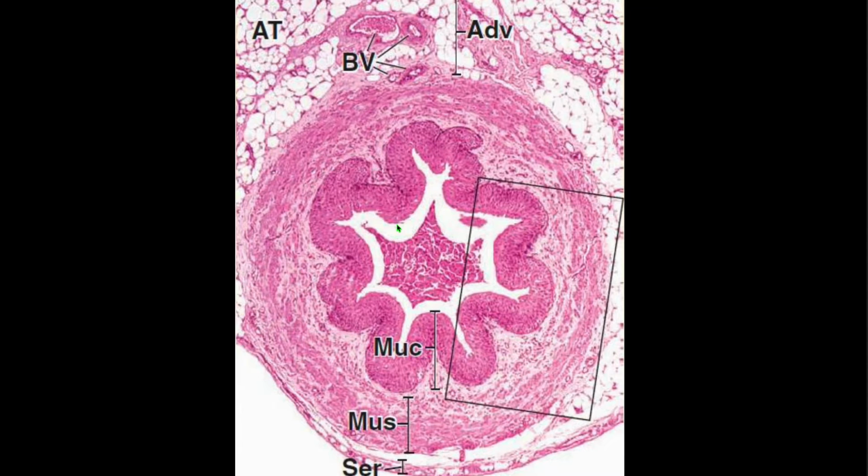The ability of this epithelium to become thinner and flatter allows all of these passages to accommodate to distension by the urine. The epithelium rests on a dense collagenous lamina propria, which in turn rests on an inner longitudinal and an outer circular layer of smooth muscle.